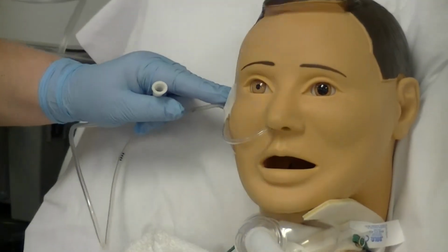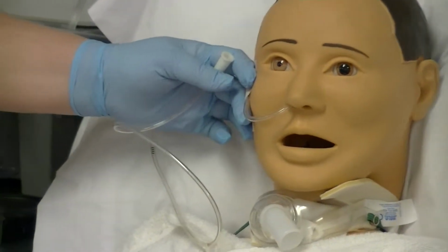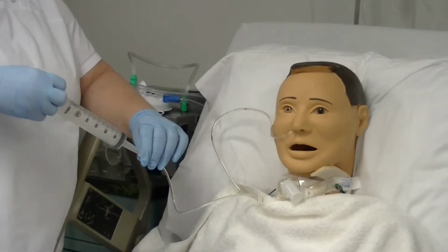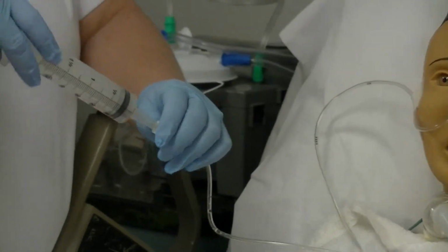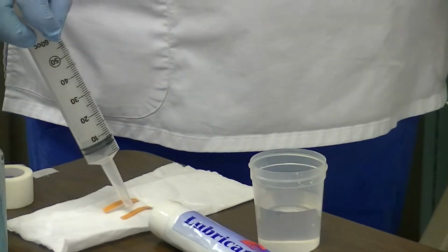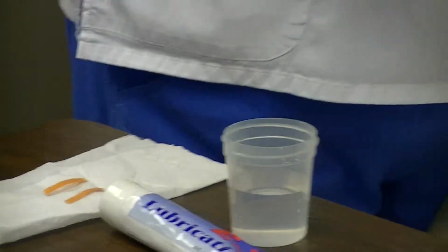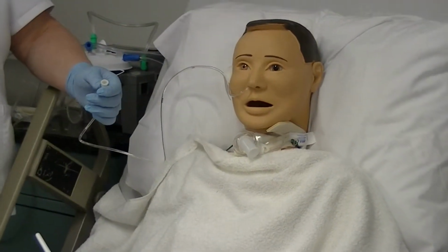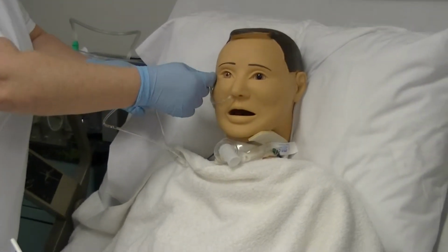If there's no presence of a coiled tube, you can go ahead and attach a 60 cc syringe to the end of the tube and aspirate gently to obtain gastric contents. You will then need to check the pH of the contents using the pH paper provided. You will need to obtain an x-ray per the physician's orders before initial enteral feeding to check for proper placement.